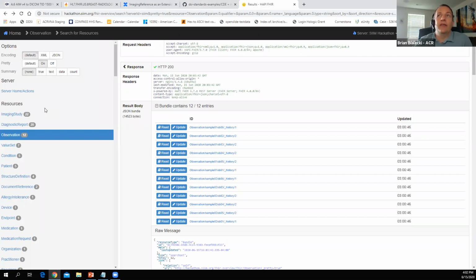Creating these observations at very specific points is also something where we can go further with clinical care guidelines. If I'm talking about a very specific finding and I want this particular mass biopsied, when the order is created for my surgeon to perform that biopsy, they can link directly to the image and have that image brought up directly with that arrow pointed on.